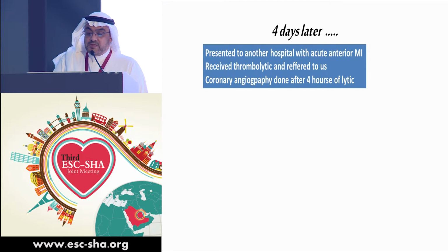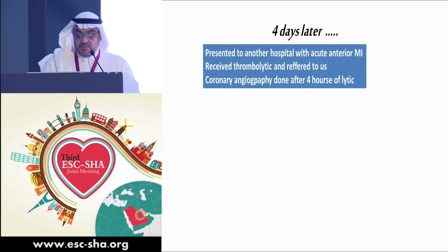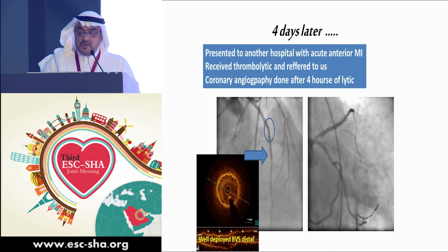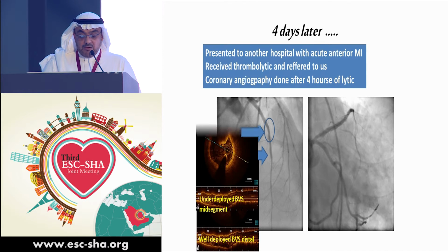He received thrombolytic and was referred back to us for angiogram. This is 4 hours after. So this is his angiogram after. Thank God, he's thrombolysed, and the flow is restored here. This is before, but again, what we did first was an OCT to see what happened. The stent distally was well deployed. However, the same area is underdeployed, the same as what we saw before.